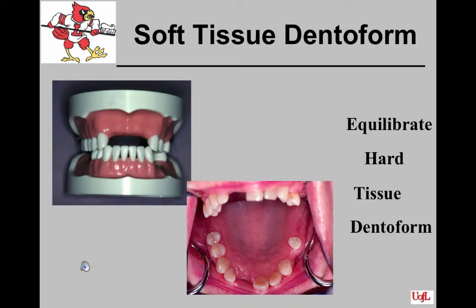The patient may or may not require an occlusal equilibration. If you have a defined maximum intercuspal position and enough teeth that there is no doubt where the patient closes to function, then you may use maximum intercuspal position.